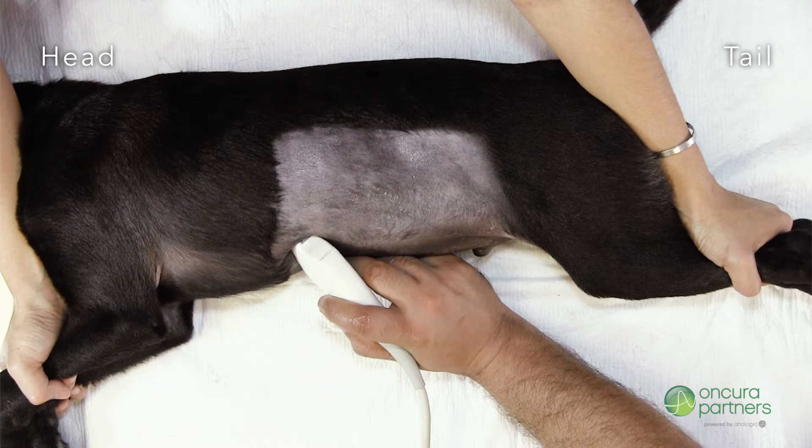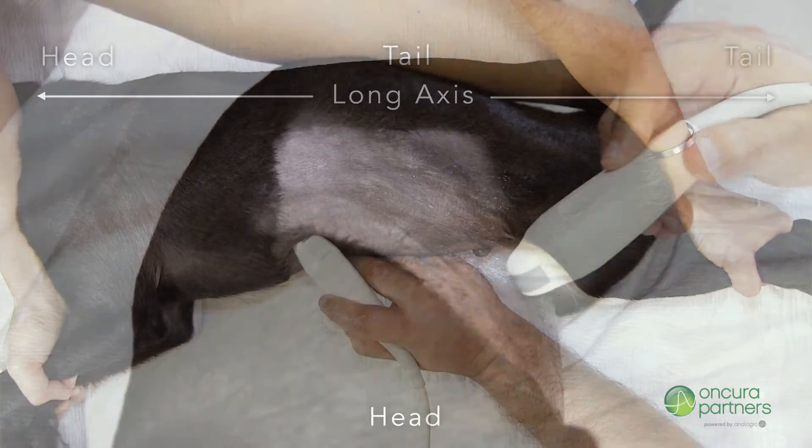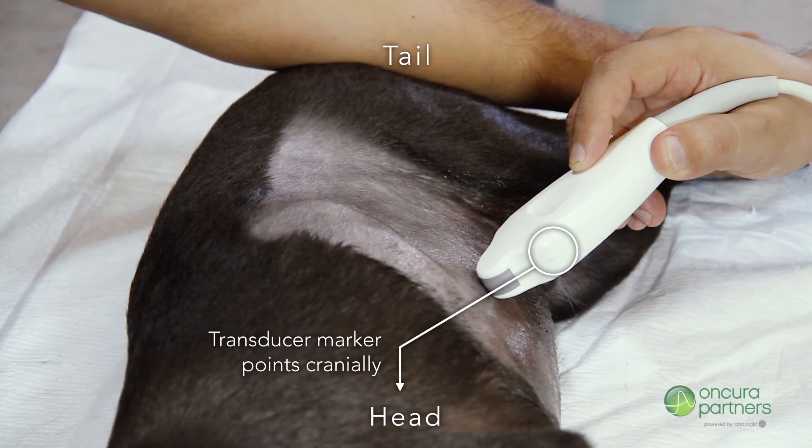From this position, there are two approaches to obtain long axis images of the liver. For either of these long axis approaches, ensure the transducer marker is always pointing cranially.